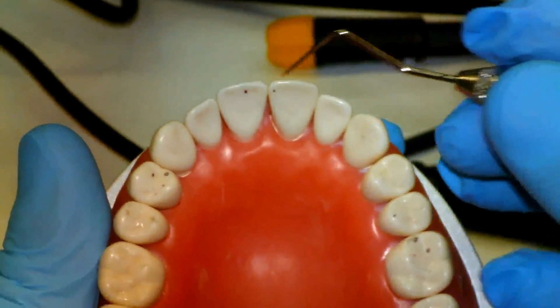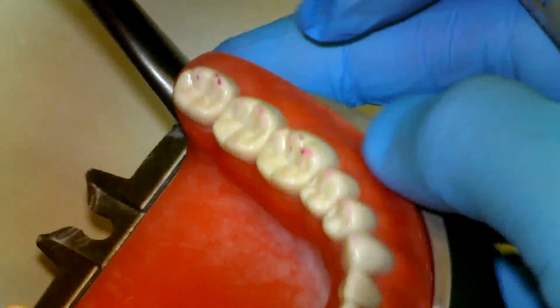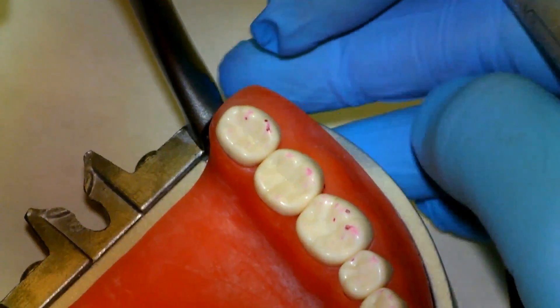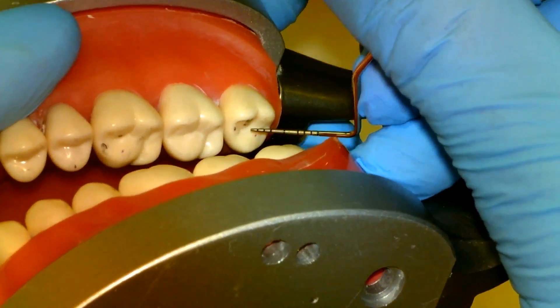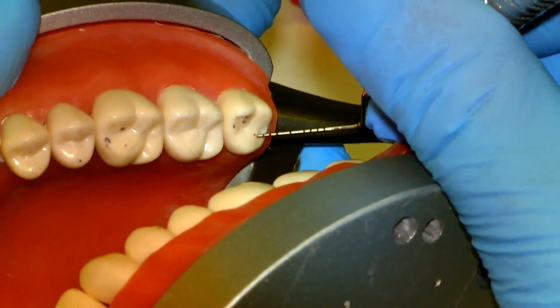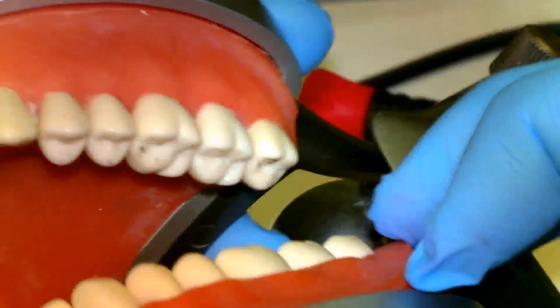First we want to take a look at our occlusal marks and try to match them up with the corresponding arch. Starting in the posterior, we can see one, two, three marks on our functional cusp. We see them interdigitate with our marks on our maxillary tooth. We have one on the marginal ridge, one on our non-functional cusp, and one on the incline of the functional cusp hitting on the incline of the opposing functional cusp.